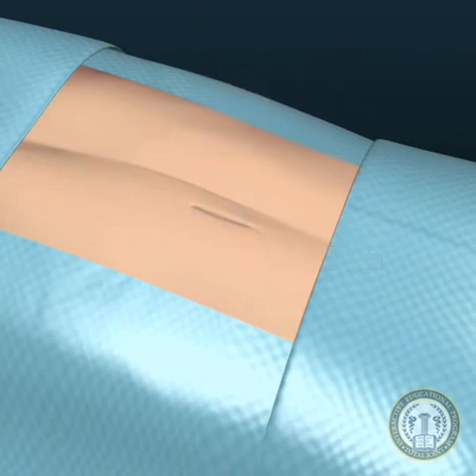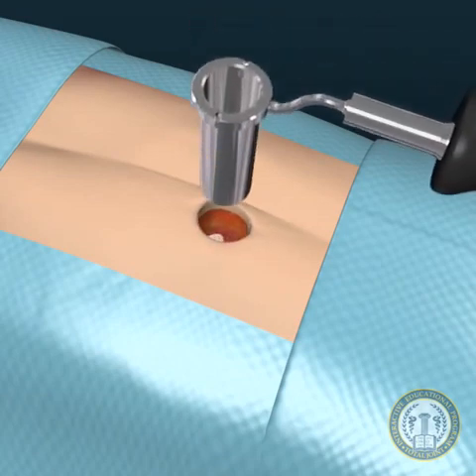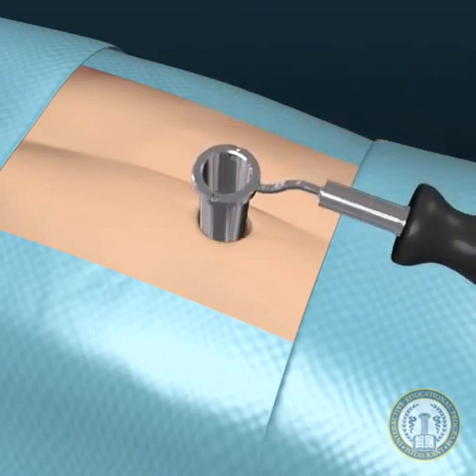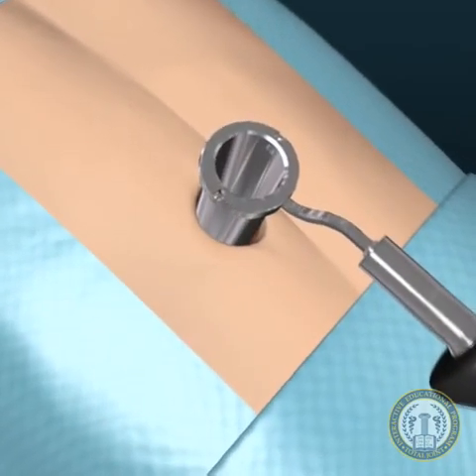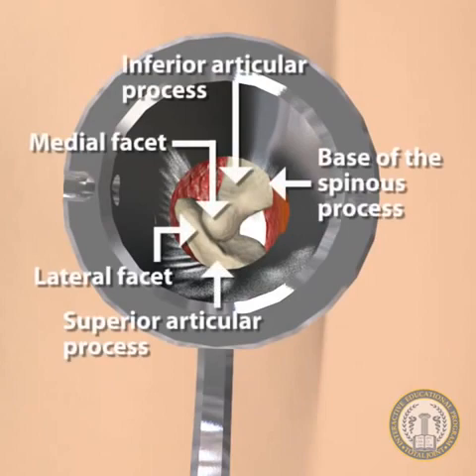of interest. Any commercially available tubular dilating type system may be used to split the paraspinal musculature and dock a tubular or expandable retractor onto the laminofacet junction under fluoroscopic guidance. This initial exposure then reveals the ipsilateral lamina and base of the spinous process as well as the medial facet complex.